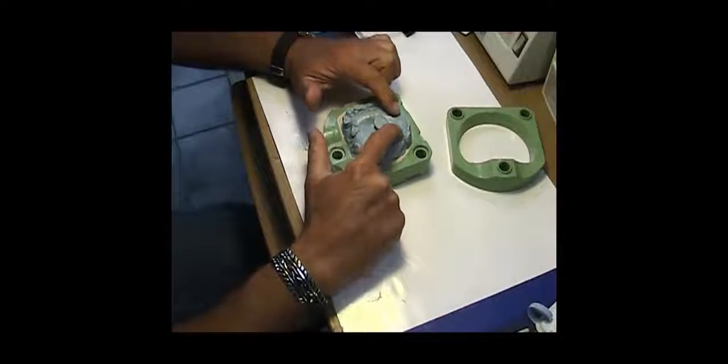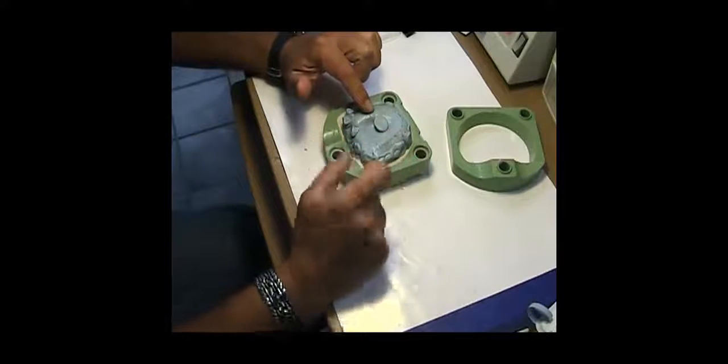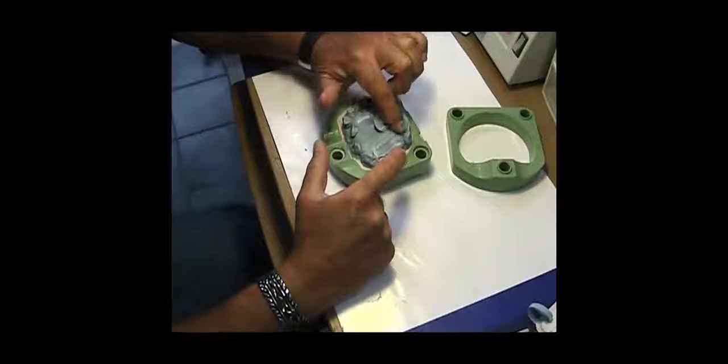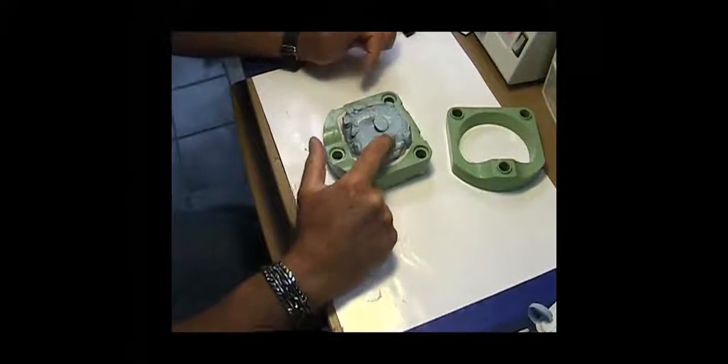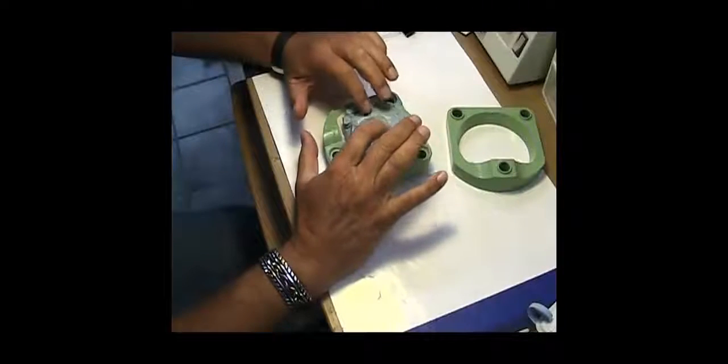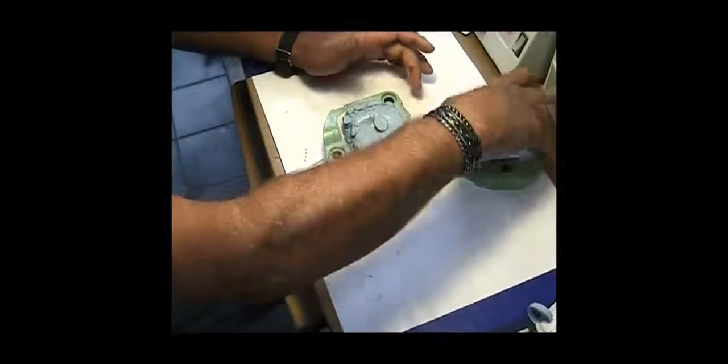I always make sure to put the cusp tips through the putty just slightly so you can see them. This gives a rigid, stationary point or foundation for when I pour the stone on the secondary cap.